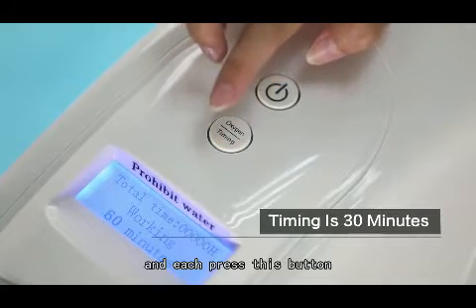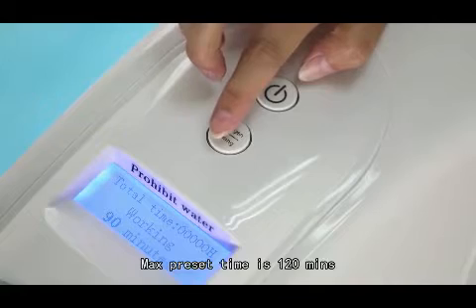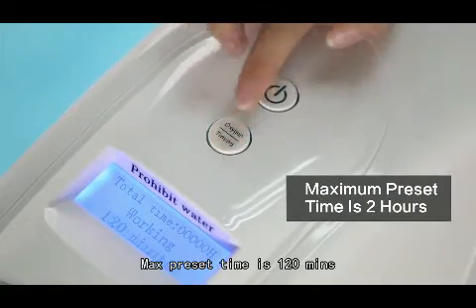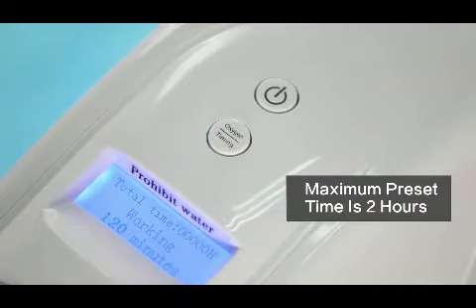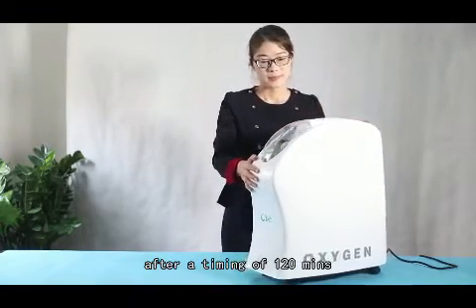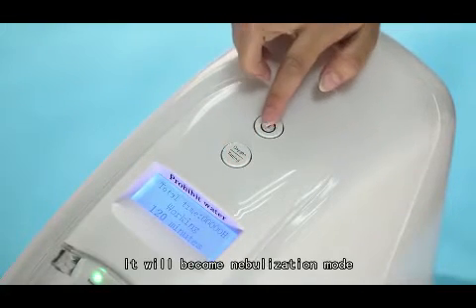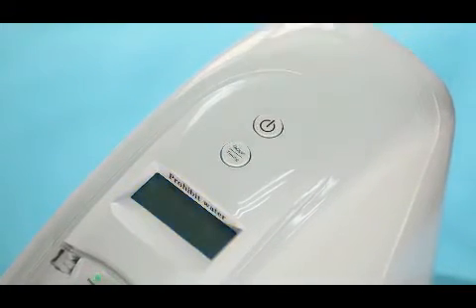Each press of this button increases the preset time by 30 minutes. The maximum preset time is 120 minutes. If the unit comes with a nebulizer, after the timing of 120 minutes, press this button again. It will become nebulization mode.